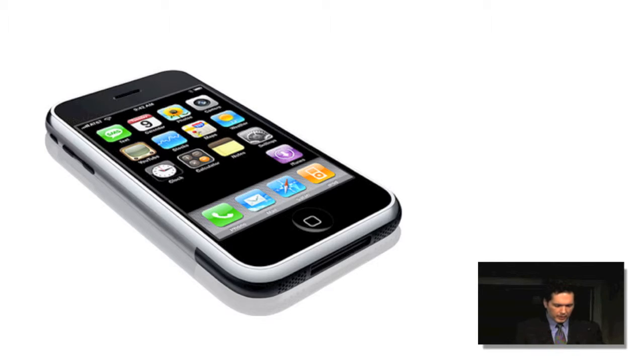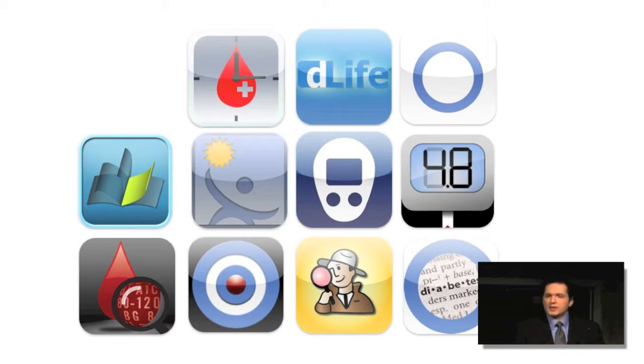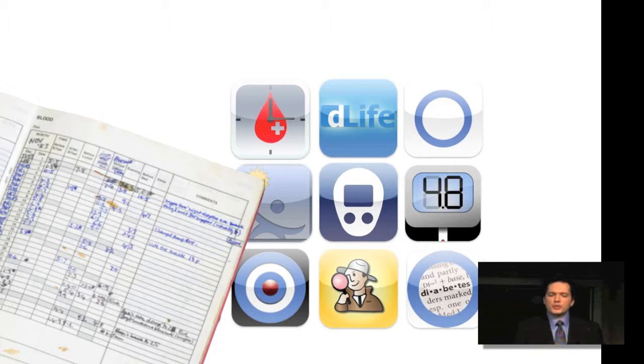And when we looked at the App Store, we saw lots of diabetes applications already on the market, right? So we had a look at them, and most of them were just electronic versions of their paper counterparts. So most people with diabetes have this logbook of some sort. Sometimes it's a little booklet, and they log all this. And these applications were really just electronic versions of those, and we really didn't believe that the use of an electronic logging tool would improve health outcomes, because that is, in the end, our outcomes. We're looking at health outcomes here, not just a gadget that makes the patient happy or makes the clinician happy, but we're looking at health outcomes. Can it improve health outcomes?